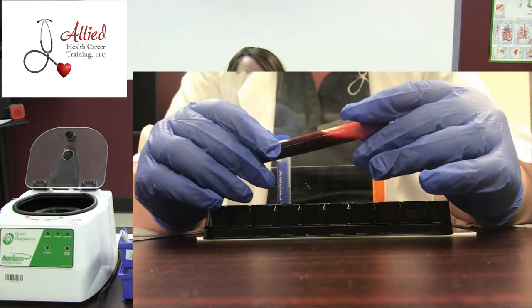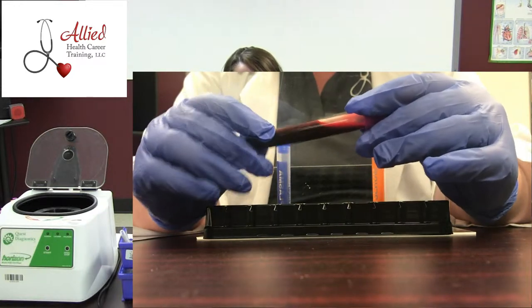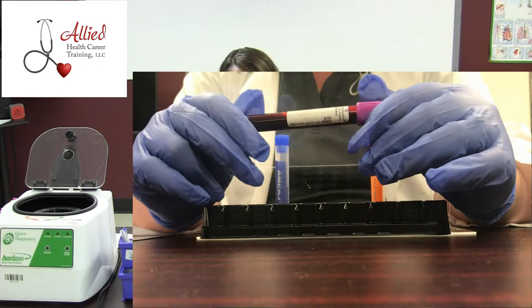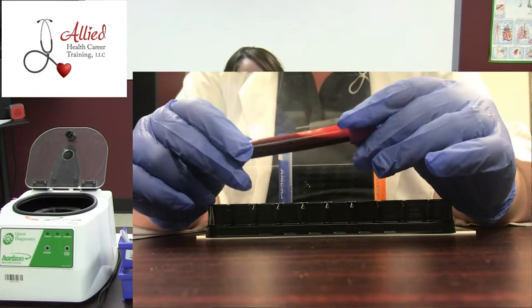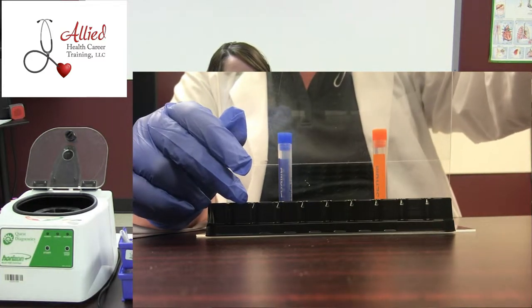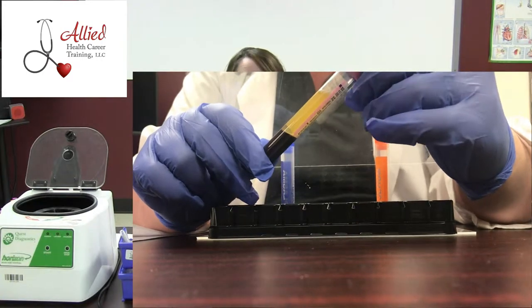Most of us are very familiar with whole blood. As phlebotomists, that's what we take out of the body — whole blood. If we add an anticoagulant to the blood, that leaves it in its whole form. Sometimes we have to transform this blood, and if we do that with an anticoagulant, we're going to turn it into plasma.